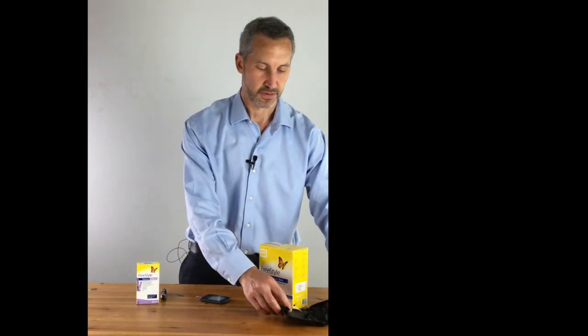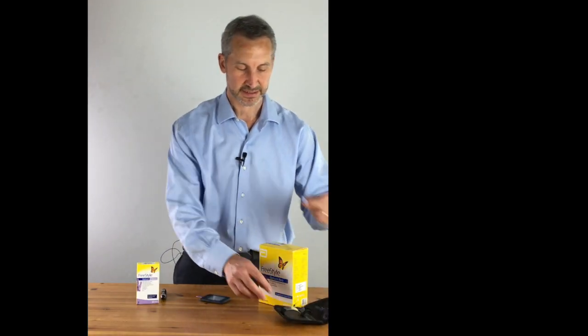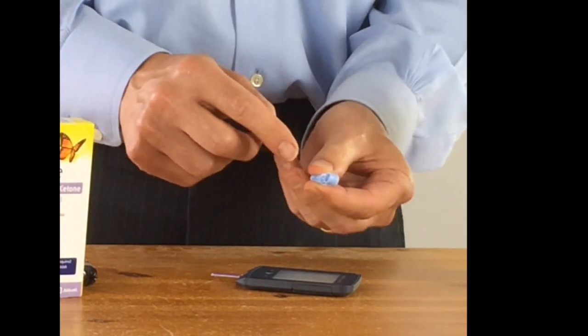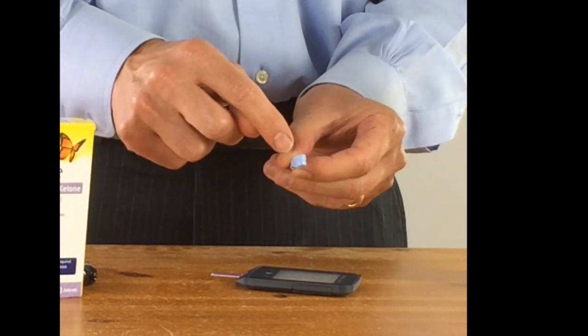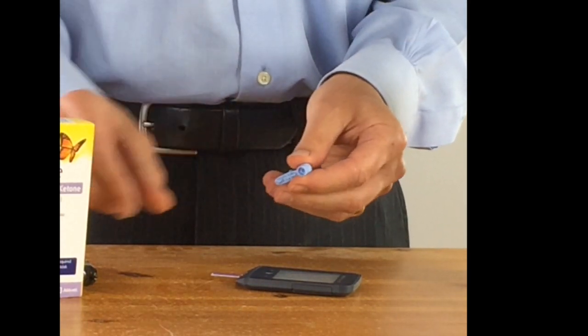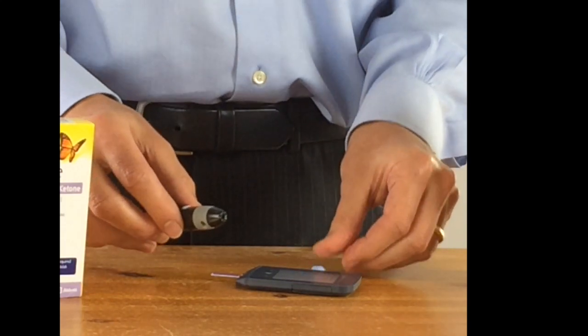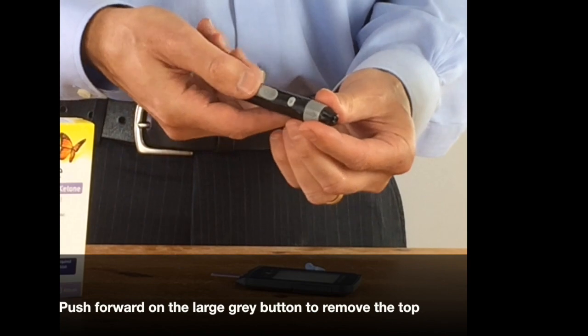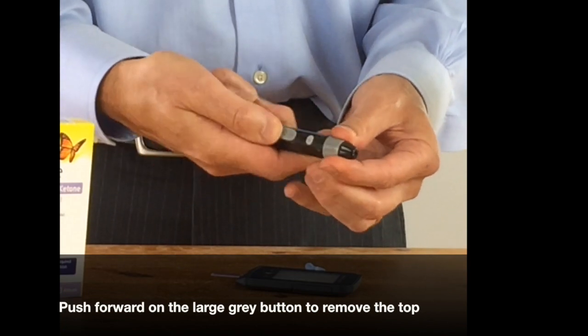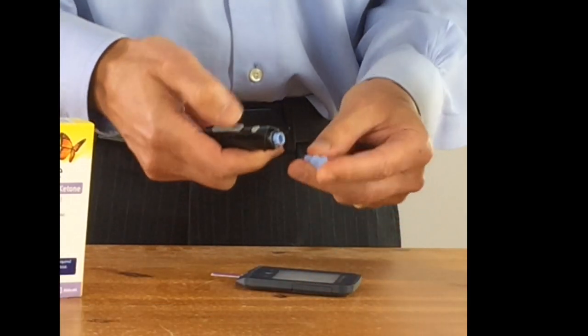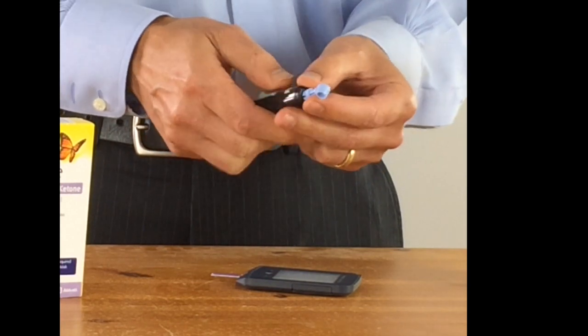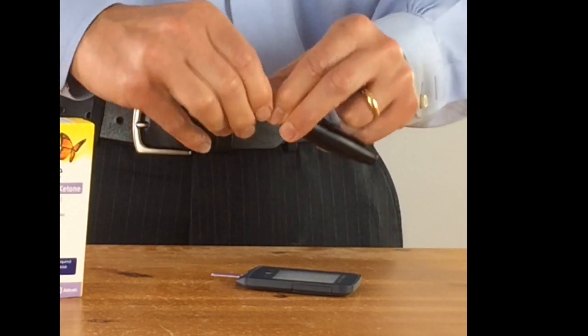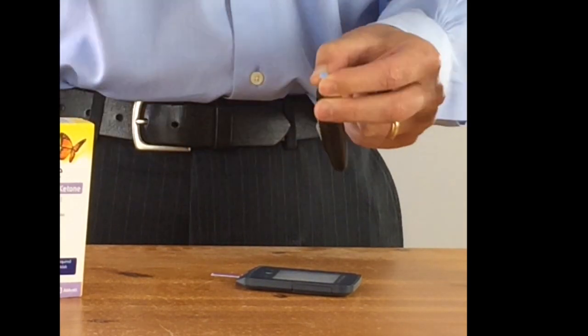You're going to then need one of the thin lancets. Now the lancet comes like this with the little round knob protecting the actual sharp part. In order to open up the actual trigger mechanism, you push forward on this grey lever which pops the top off. You put the lancet inside and then twist the protective cap off. Now keep this protective cap for later.